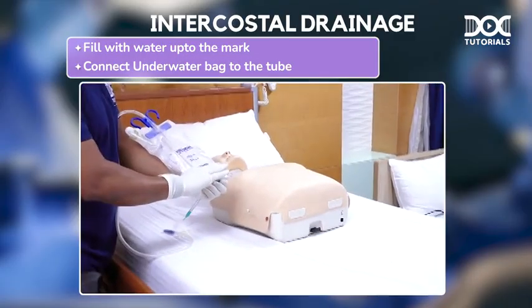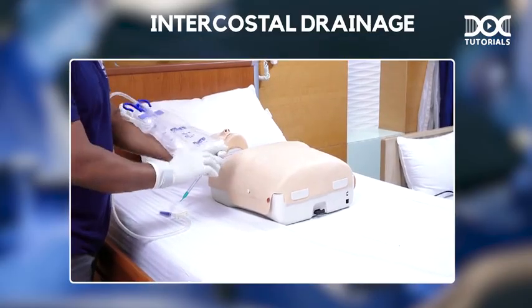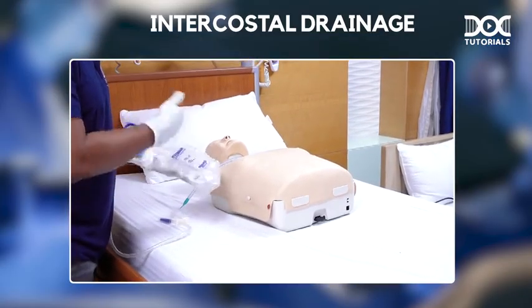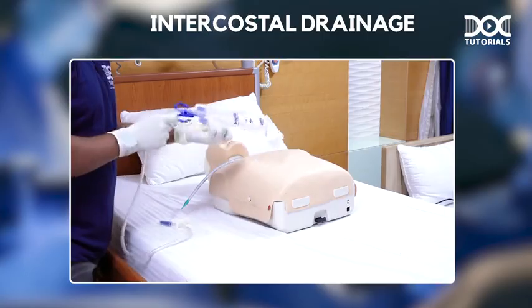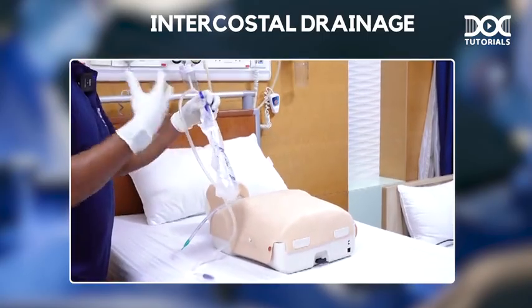So we have to fill fluid up to this line. So if you miss to fill this line, the tube is without water, definitely air from outside will go via this hole. So through this hole, air will enter and patients will develop new complications.